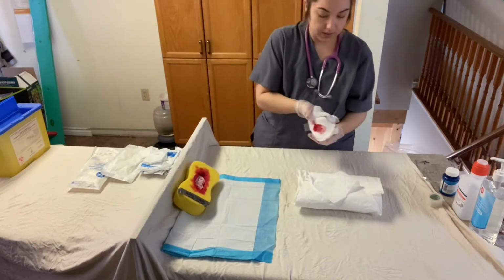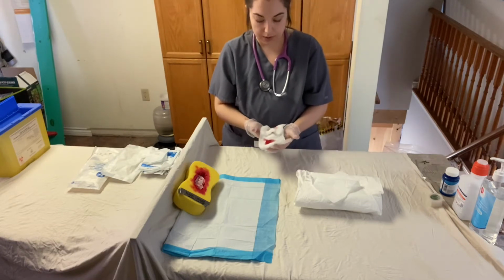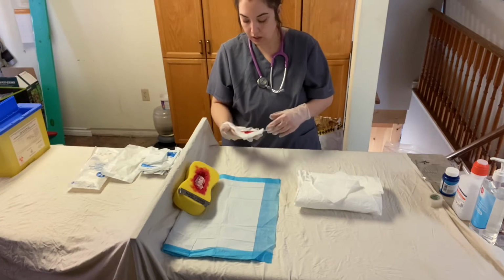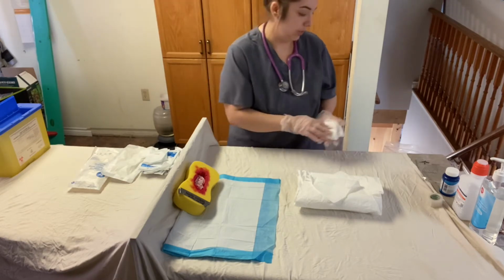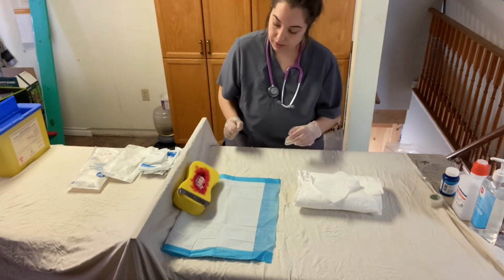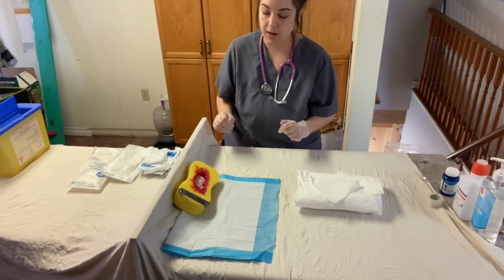And assessing the dressing here, there is some dark red, dry blood. There seems to be a moderate amount. I do see some serosanguinous fluid and drainage there, which is normal. I don't see any signs of infection there. So I'm going to throw that in the garbage. And assessing the outside of the wound there, the edges look to be well vascularized, no signs of malodor.